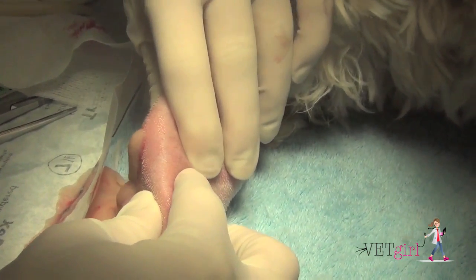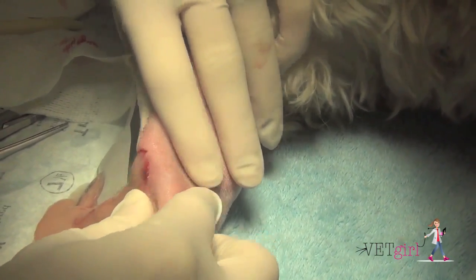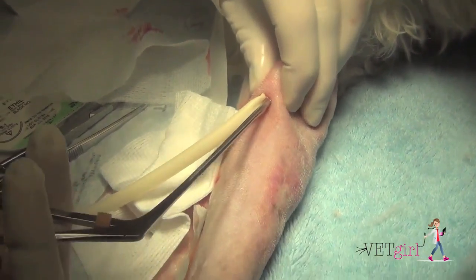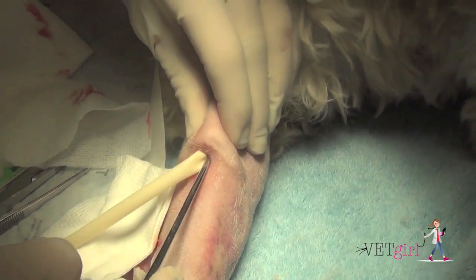Once we bluntly dissected down and created an incision, we were able to gently manipulate the tissue to help squeeze out all that purulent discharge. Again, a great rewarding case. Our ultimate goal here is to create an opening that will allow this purulent discharge to drain and to flush it well.